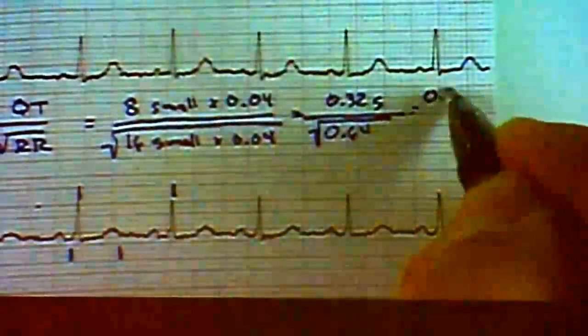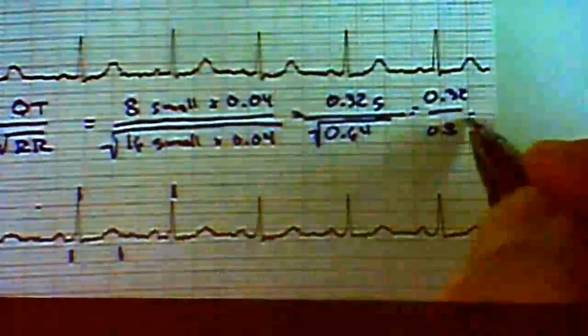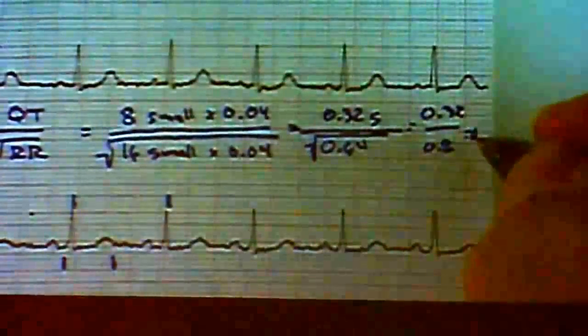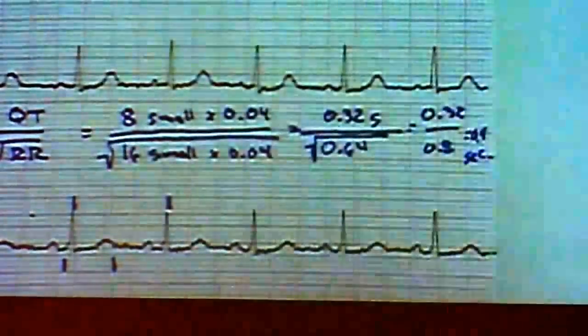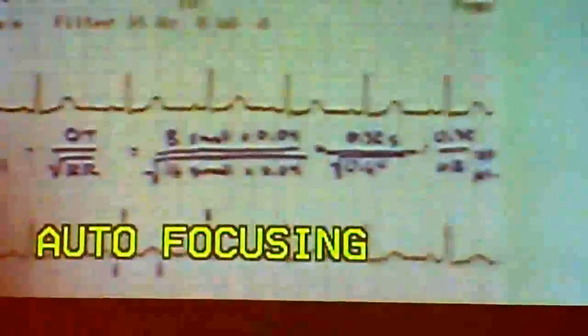So now we have 0.32 divided by 0.8, and our answer is 0.4 seconds. Okay, so let's go through it again.